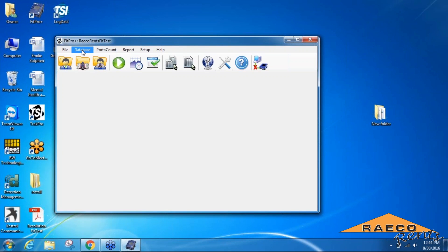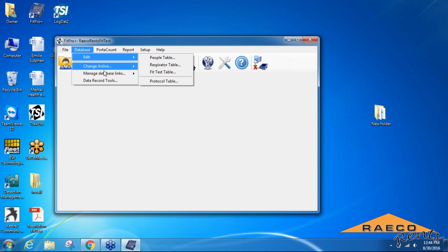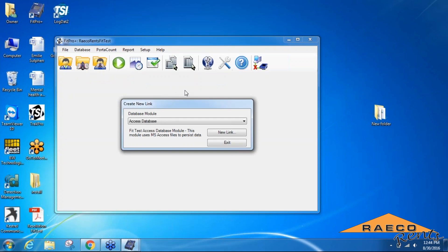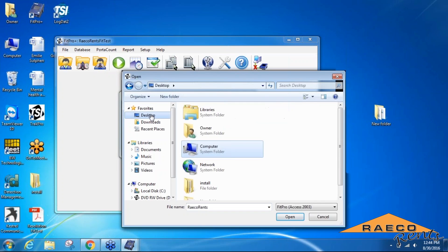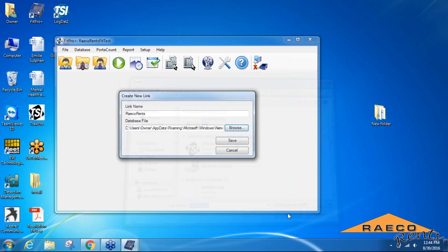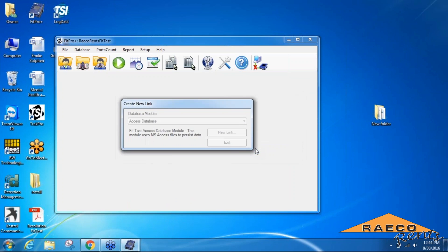The first thing we're going to do in the FitPro software is create a new database link. At the top of the window in the software program is a tab labeled Database. We'll open that, and underneath the Change Active header you're able to select a new database link. We'll do a Microsoft Access database and click the New Link button. We'll name it whatever we want - this will be Reiko Runtz - and I'll save that to the desktop for convenience and create new database.